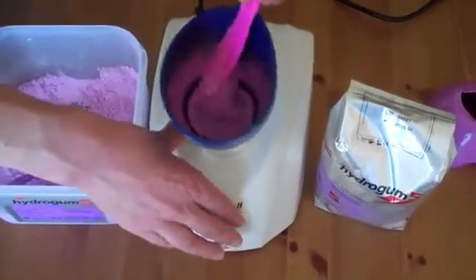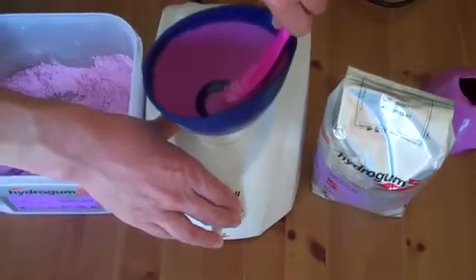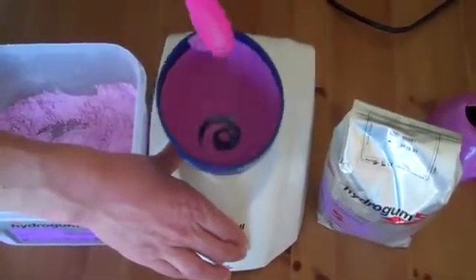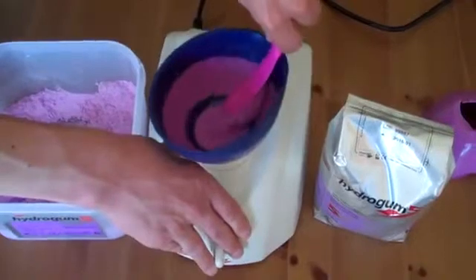And once this is done, onto the fast speed, putting pressure on the side of the bowl — a reasonable amount of pressure to get the bubbles out. Any excess, just put onto the side and put back in.